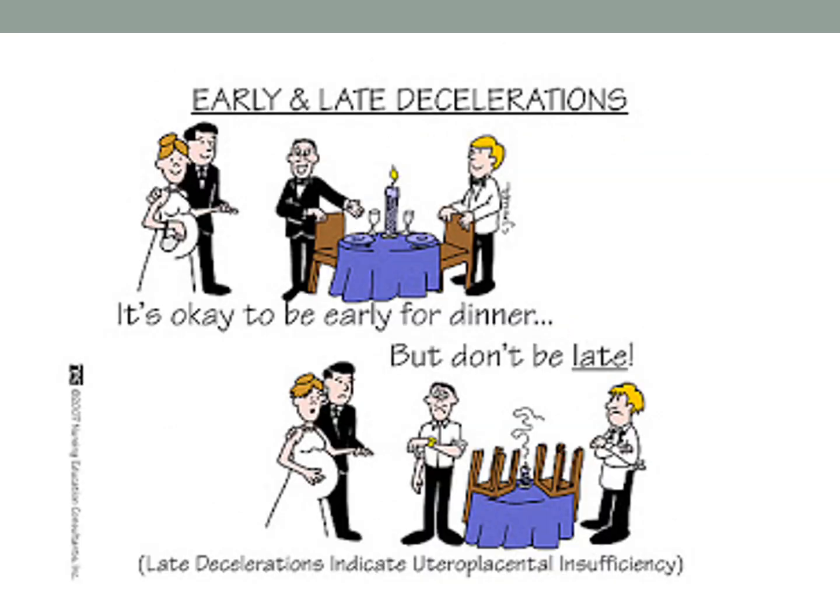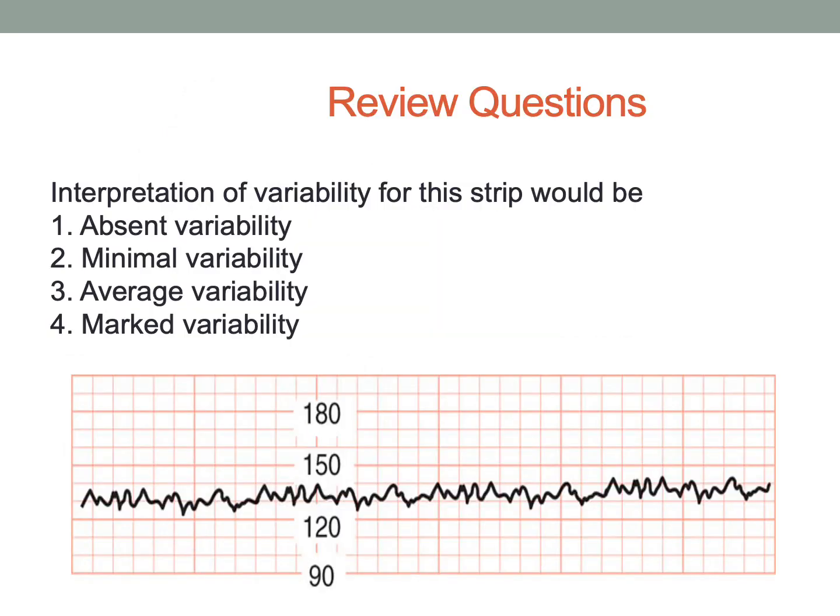And then this is just something for you guys to laugh. It says, it's okay to be early for dinner, but don't be late. Remember that. So it's okay to be early. So if you have early decelerations, we're not concerned. But if you're late, you're in trouble.